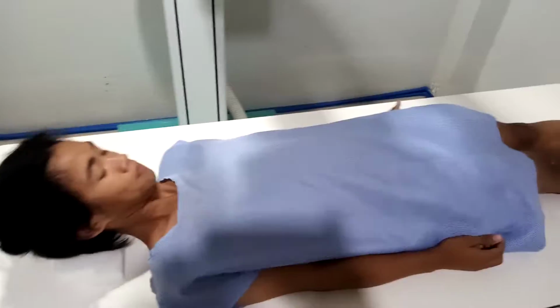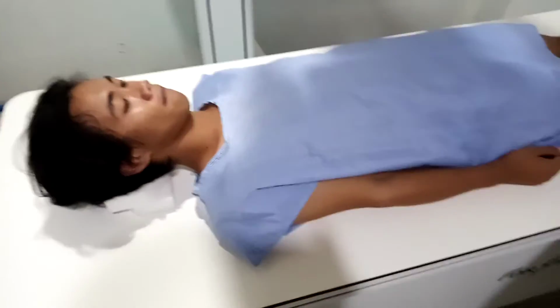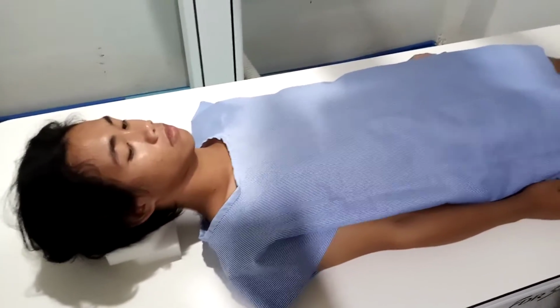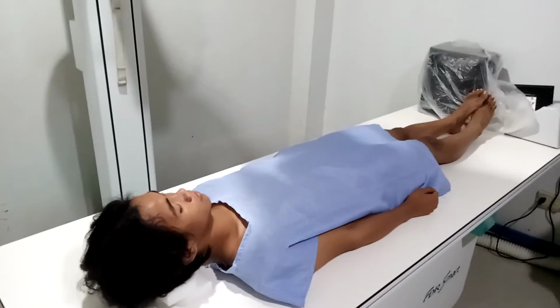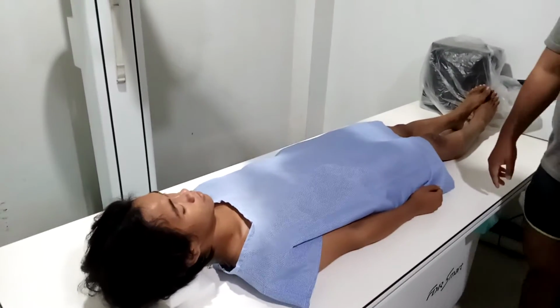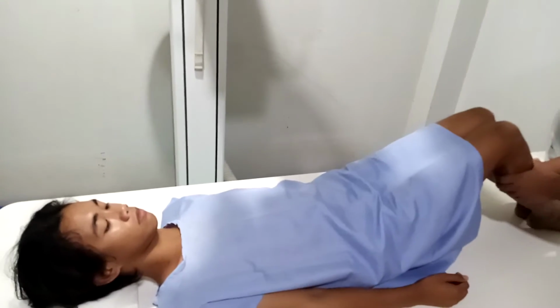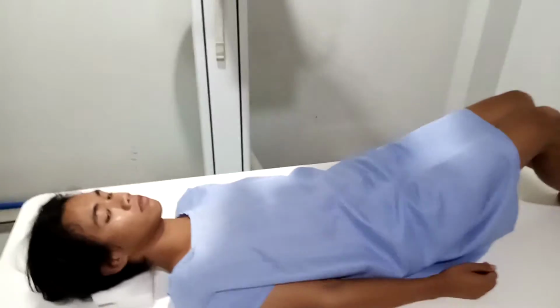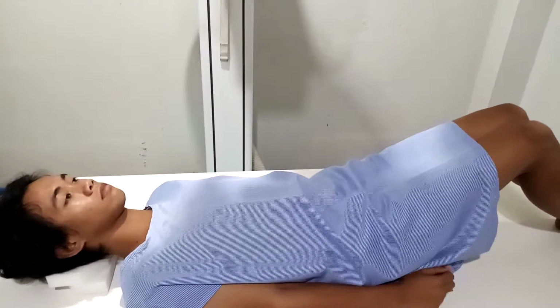Okay. Then part position is center the mid-sagittal plane to the grid. So may grid sa ilalim. Center. Then flex the hips and knees of the patient to place the back in firm contact with the table. The reason why we need to flex his hips and knees is to straighten his back. Then center the IR at the iliac crest at the level of the lumbar, L4.